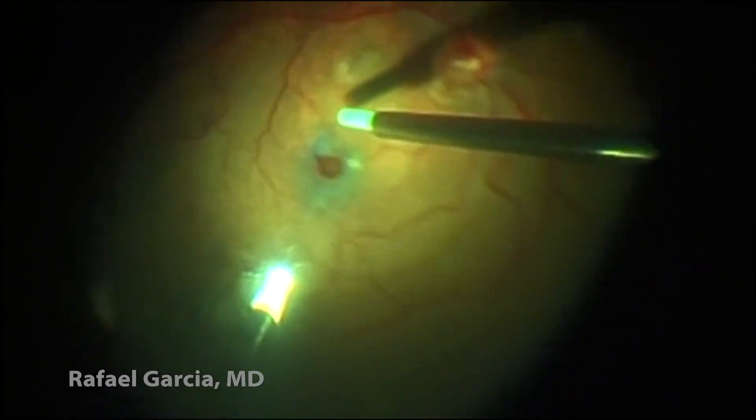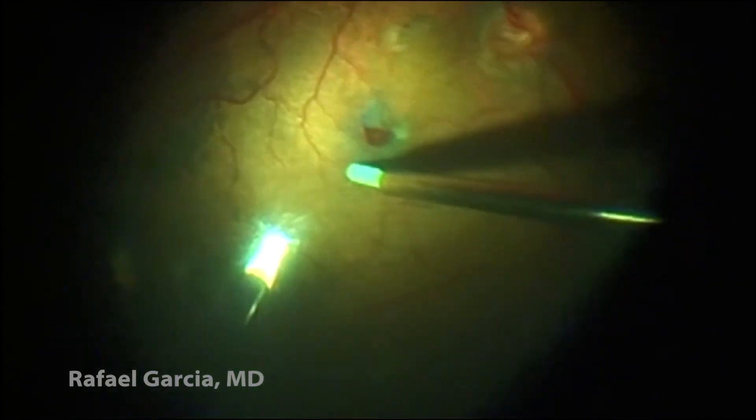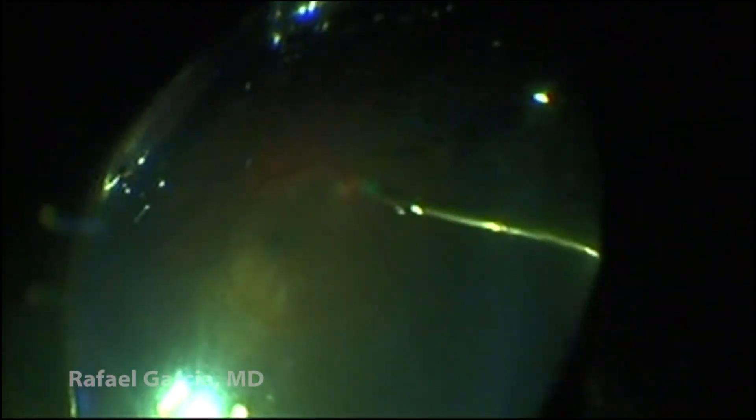Now, using a soft-tip cannula, we mechanically approximate the borders of the hole. We think this maneuver may help its closure. The peripheral retina is checked under scleral indentation, and finally a fluid-air exchange is performed. The patient is left with perfluropropane in the vitreous cavity, and is oriented to maintain a face-down position for 7 days in the postoperative period.